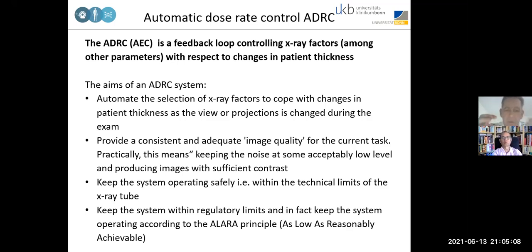Do the ones you know your operator is usually using: LAO 45, LAO 60, RAO 60, or RAO 90. These are very common angulations. Test those, and not 70.5 degree LAO or something like that, which is maybe not used at all during the entire examinations.